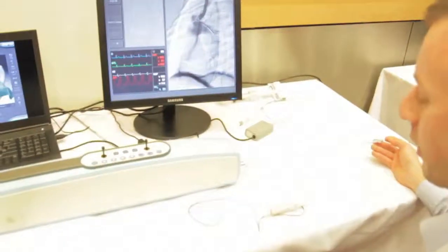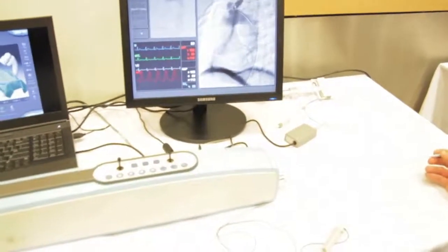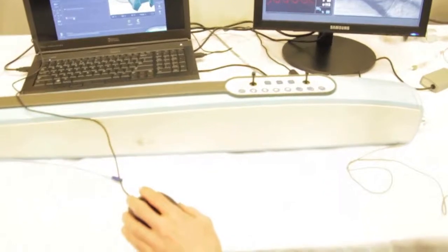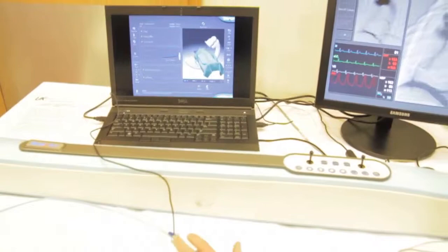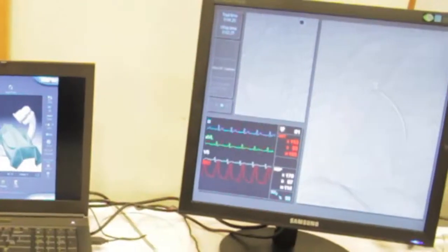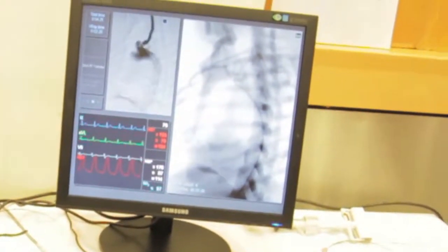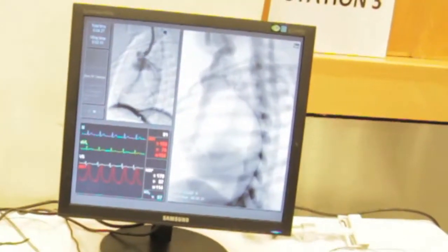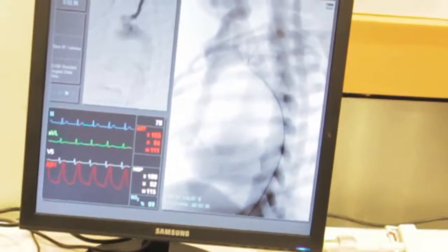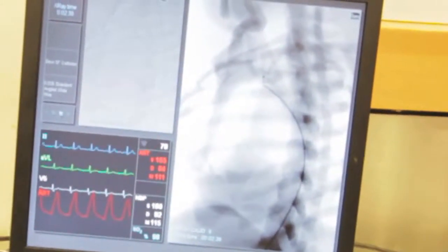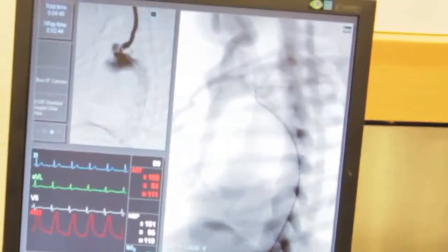We now want to advance the catheter, so we need a guide wire. We're going to exchange the J-tip guide wire for something more suitable — a standard angled hydrophilic wire, which is generally what we'd use. The catheter has fallen out because I let go of it, so we re-select it. Very gently advance the guide wire — this is the critical point. As the guide wire just comes out of the catheter, two things can happen: the catheter can back out, or you can cause a dissection. So just be very careful at this point.